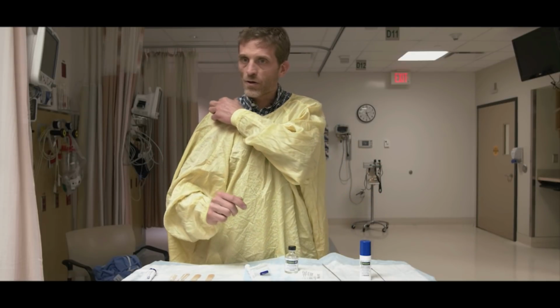Although, you could certainly just do what we did in the video, put it straight back, turn the direction down, and just have Chad or the patient inhale a couple more cc's, and I think that would have more than adequately anesthetized the cords, the epiglottis, the posterior cartilages. So we did that at 8 minutes. The whole thing took 18 minutes, but I think with a methodical, prepared approach, you can be ready to pass the tube certainly by 10 minutes.